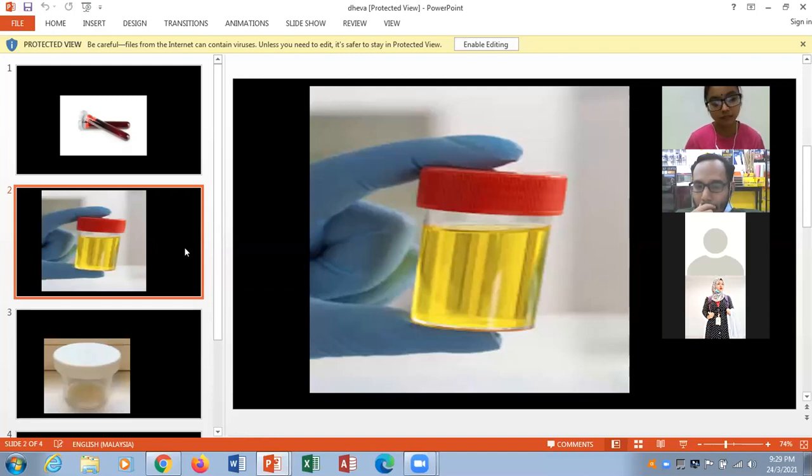Okay, for the urine, the urine container should be clean and free of particles or interfering substances. The collection container should have a secure lid and be leak resistant. A leak resistant container reduces specimen loss and healthcare worker exposure to the specimen, while also protecting the specimen from contaminants. It is good practice to use containers made of break resistant plastic, which is safer than glass.